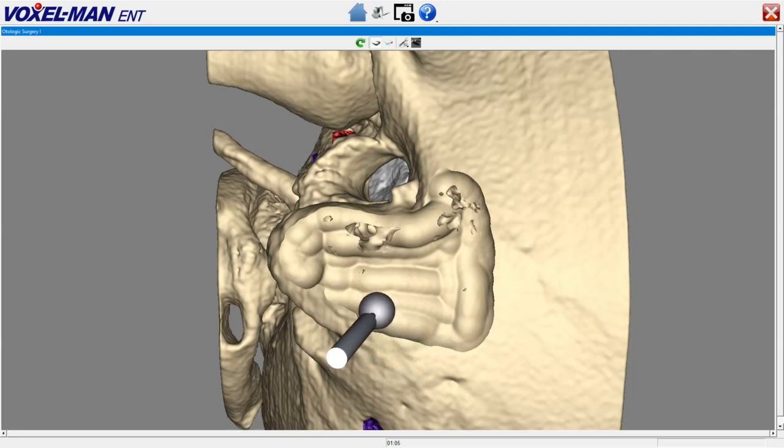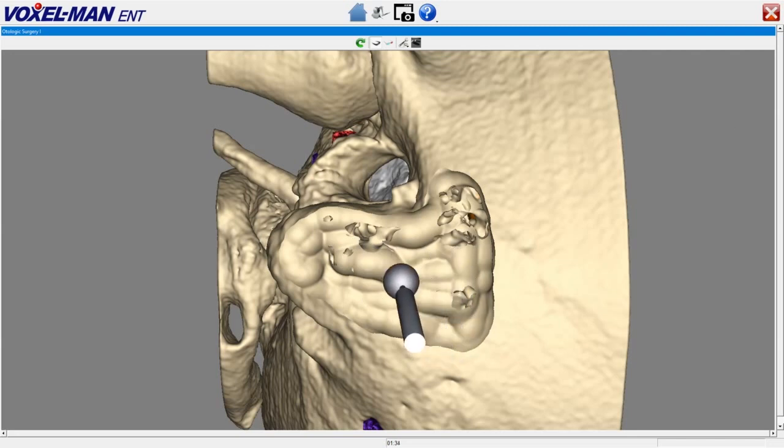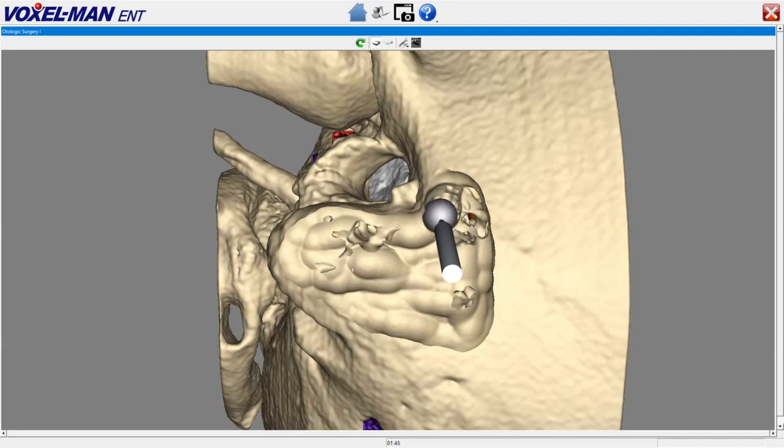Posteriorly, the boundary of your mastoidectomy cavity roughly follows the course of the sigmoid sinus. The deepest part of your dissection should always be high and anterior, because this is the location of the mastoid antrum. The aim of cortical mastoidectomy is to reach the antrum, because this is the gateway to safely finding all of your other temporal bone anatomy.